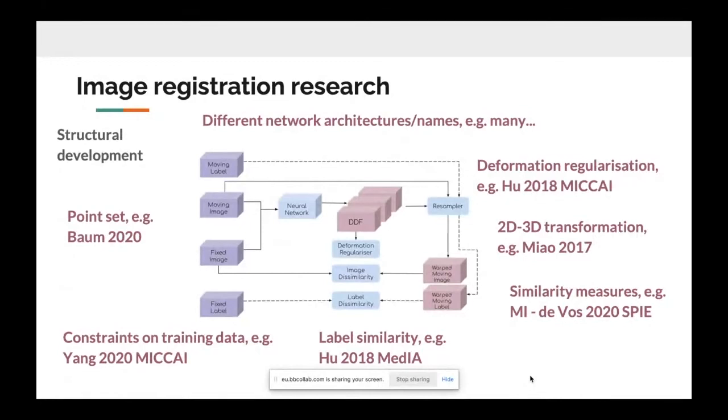And in the last 2 years, we have seen methods exploring every corner of this illustration. And my citations here are obviously very biased towards our own work. So for example, we have Zach, who points at algorithms using feature-based registration instead of the image itself. And we have Chen Ye's work looking at the different ways to sample training data.